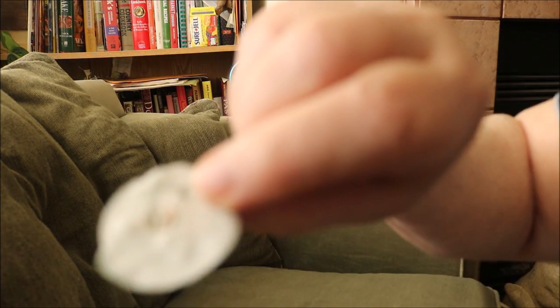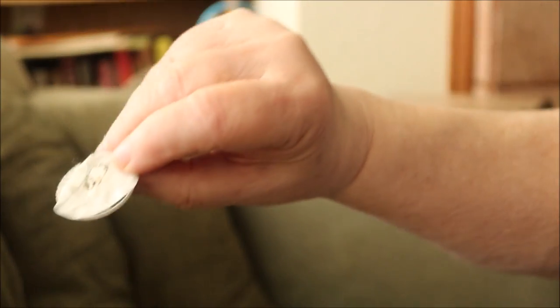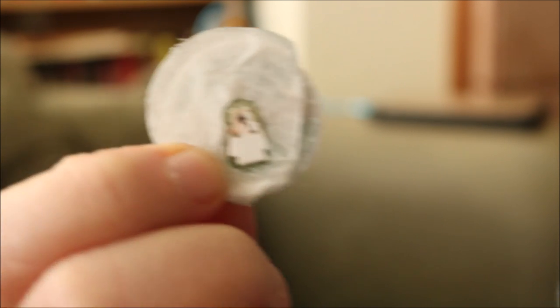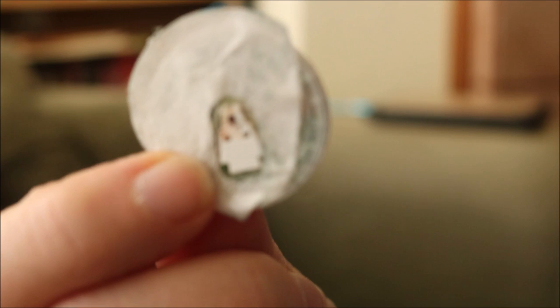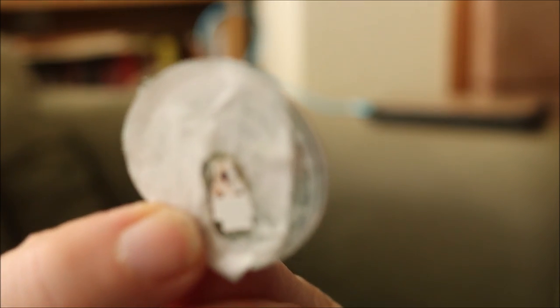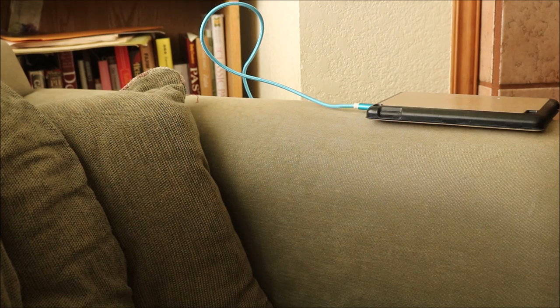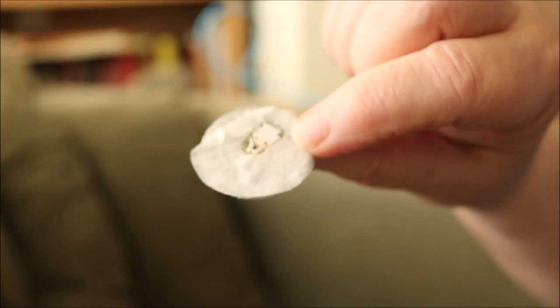Looking at the used sensor needle — it's bigger than the insulin pen needle, and bigger than the finger sticker, thickness-wise. But honestly, how many times do you stick your finger a month? I have a minimum of 120 sticks a month. I would rather stick this in my arm two times a month than 120-plus times a month. I'm going to turn off the camera while I get the next one ready.